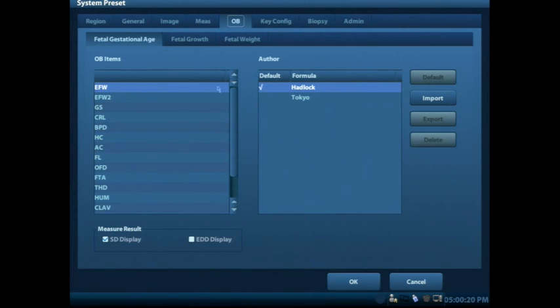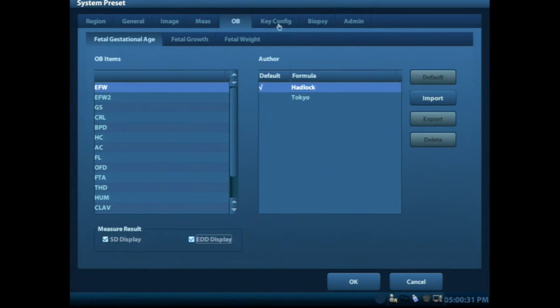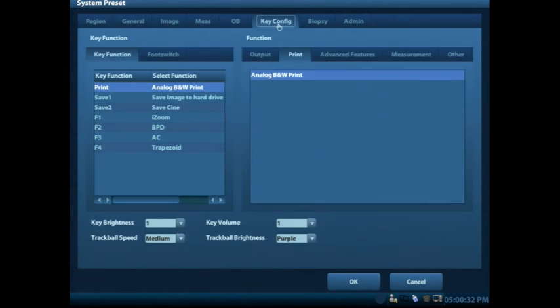As you get into the OB tab, you can look to see what the measure result pops up with, and oftentimes you'll want to click on that EDD display because that's nice to have popping up when you take your measurements.